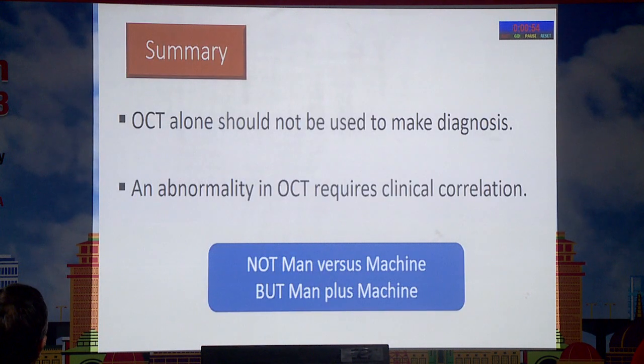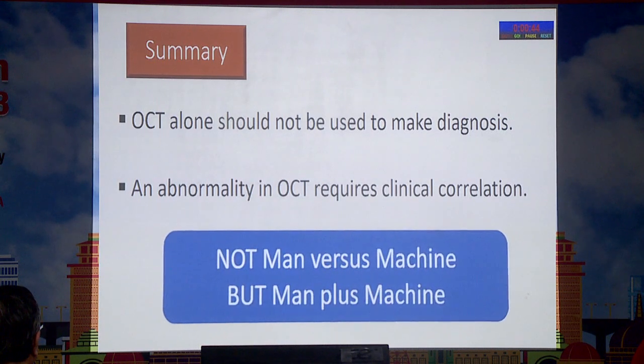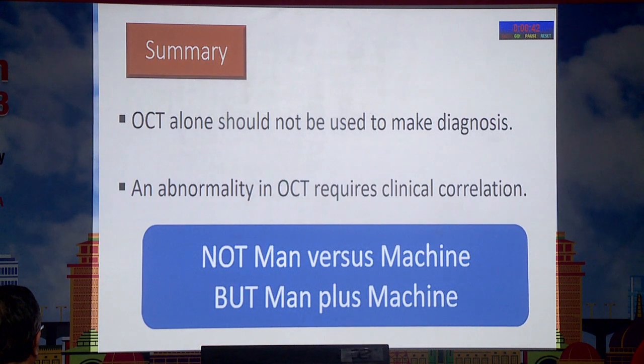To summarize, OCT alone should not be used to make the diagnosis. An abnormality in the OCT requires clinical correlation, and this is not man versus machine, but man plus machine.